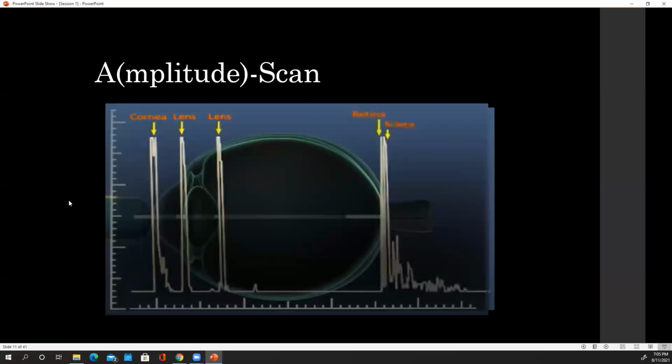So if you imagine here is a probe that's emitting. Okay, this is your ultrasound probe, or you could even say this is an OCT, which inside the OCT machine, there's something that looks kind of like this that shoots out a wave of your choice. We're doing ultrasound, so it's a sound wave, but if it was a light wave, it would be the same exact principle. It would just be a light wave. It's shooting it out and it's going through this, and then it's receiving something. So I'm going to say this is doing 70,000 of these scans per second.